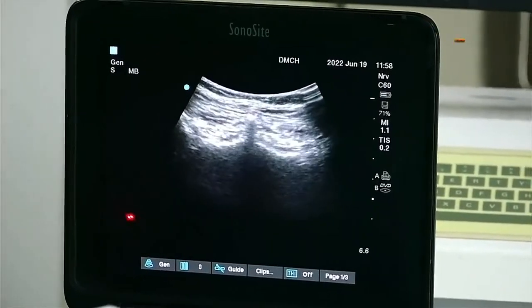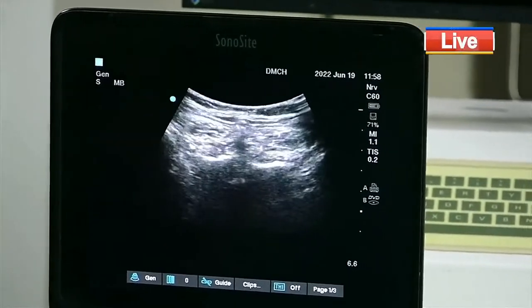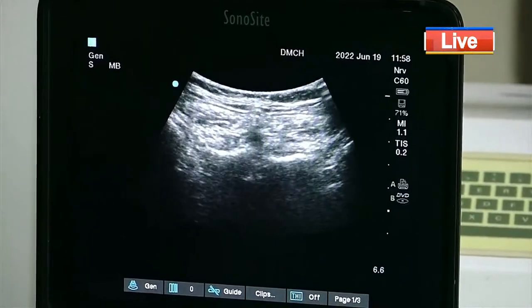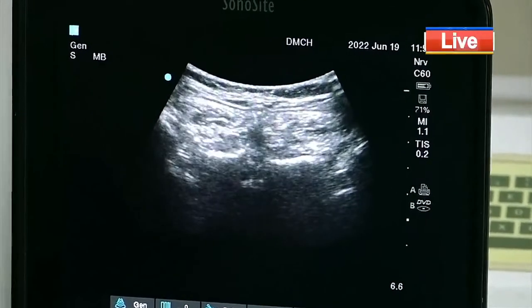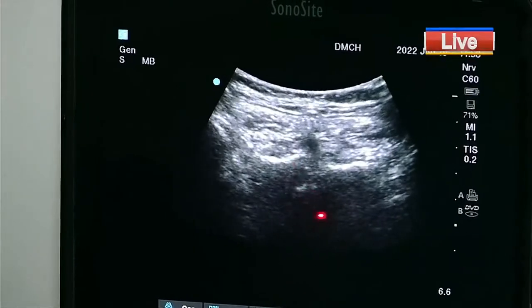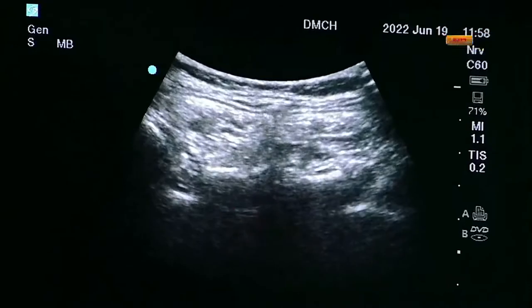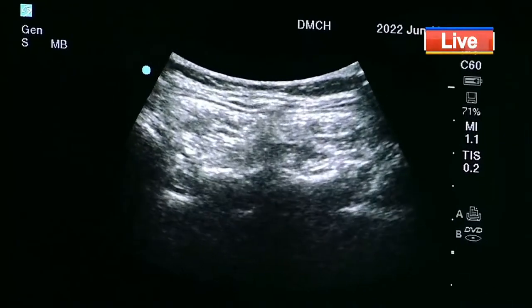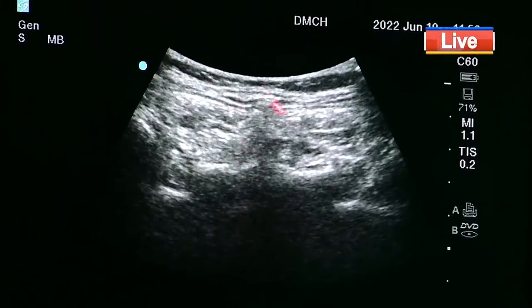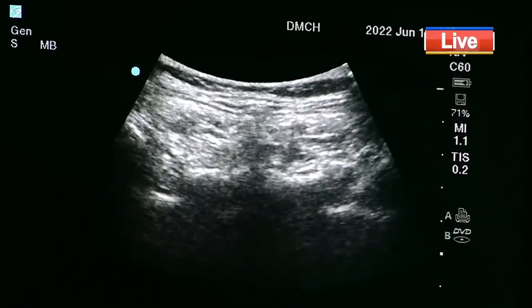So you can see the sacral crest, and as I go up slowly, now you can start seeing the elements of anterior posterior thecal sac. And yes, these are the elements. And as you go further up, now you see it's a trishul or the trident sign. Okay, so you can see three structures. One, yes, so these are the lamina masses, and you can see the transverse process.